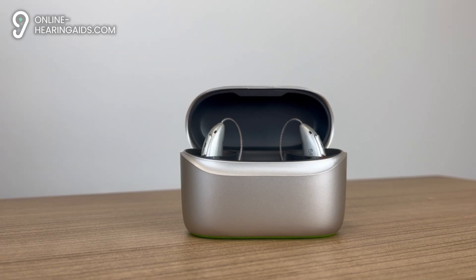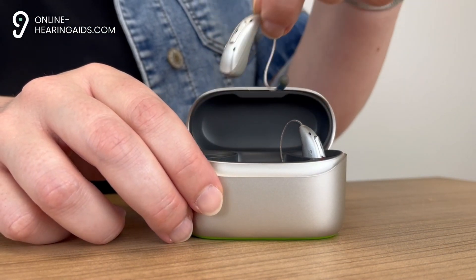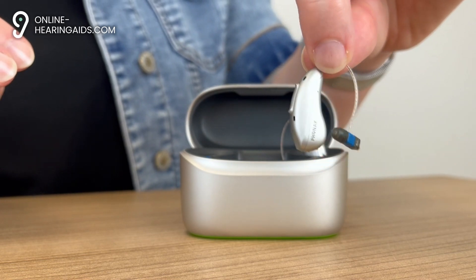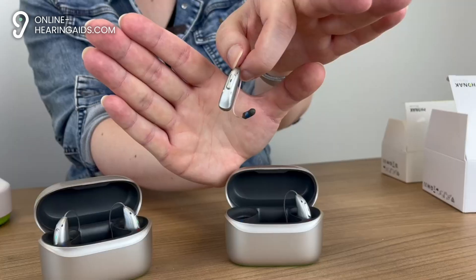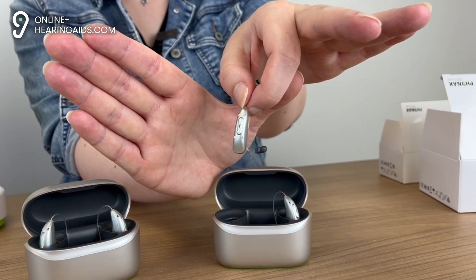Let's start with the Phonak Audeo Infineo R model. This model uses the new ERA chip which significantly improves speech understanding in noisy environments compared to the predecessor, the Phonak Lumeti series. What immediately stands out is the compact and sturdy design. This hearing aid is not only sweat proof but completely waterproof, as we were used to with the previous Phonak Lumeti Live series.